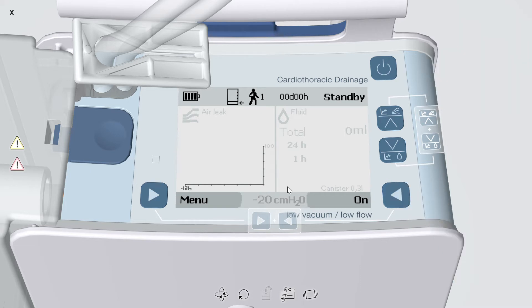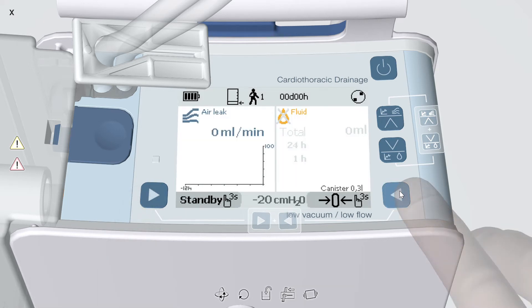Ensure that the pressure setting in the bottom center of the display is as ordered and press On to begin therapy.